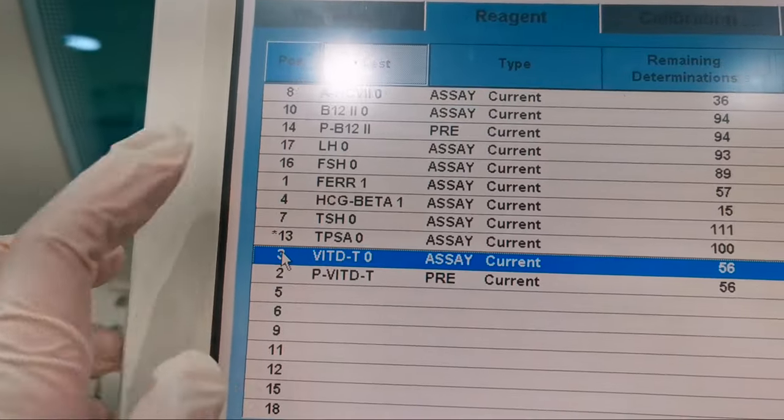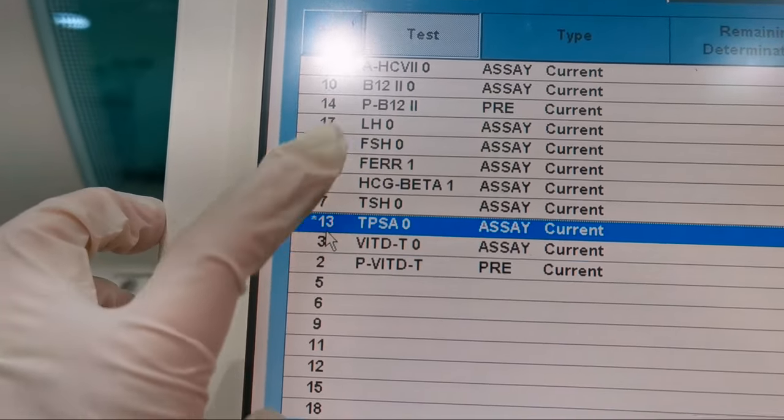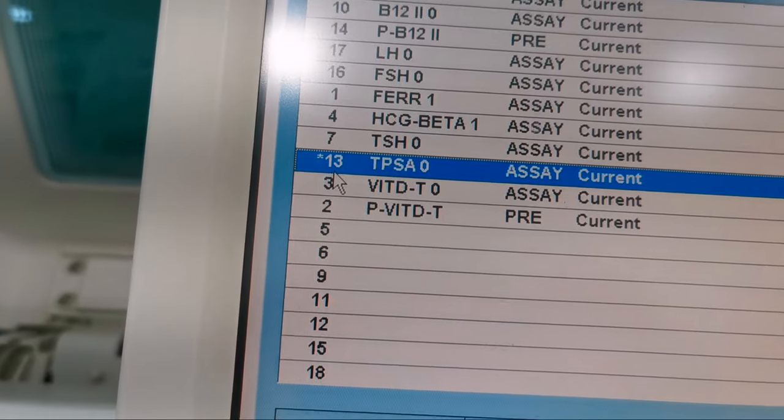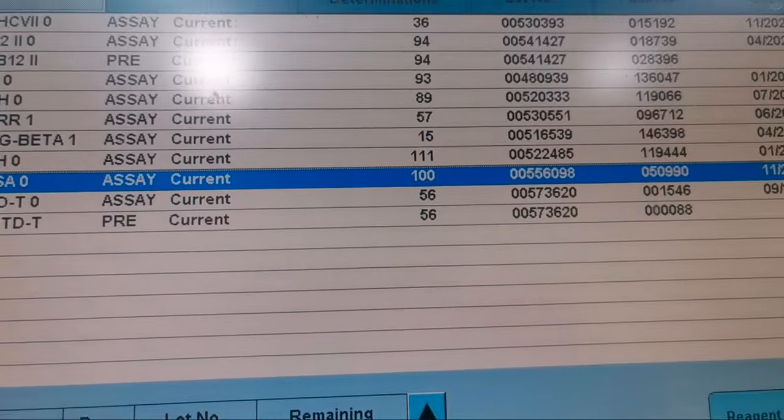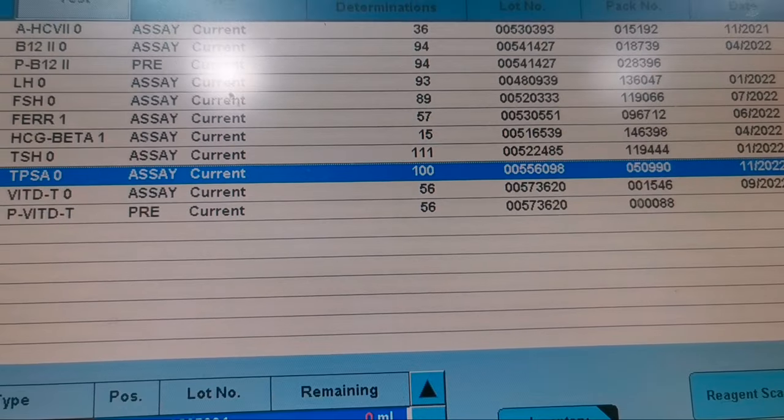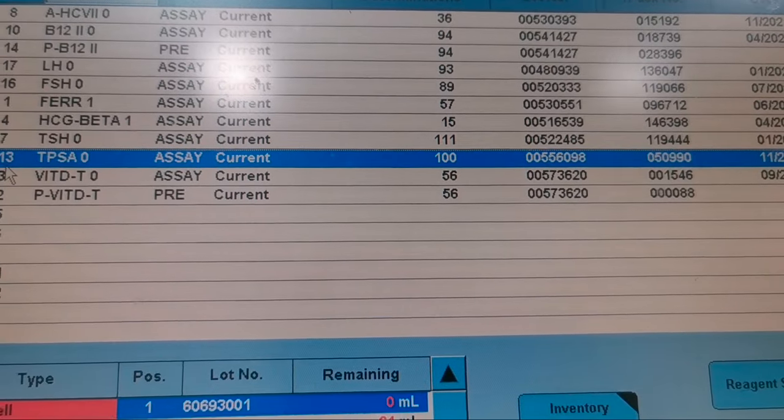Now the reagent is registered and you can see an asterisk before the position number, which means that you did the registration manually.